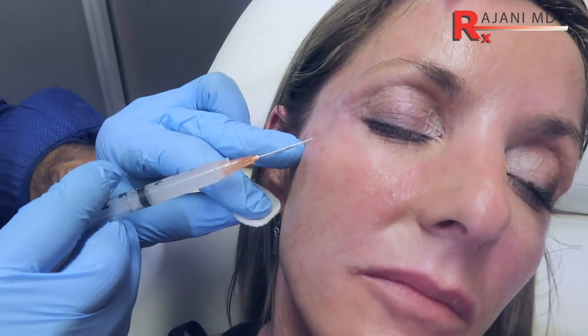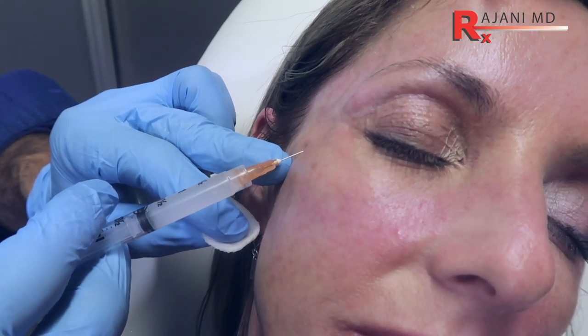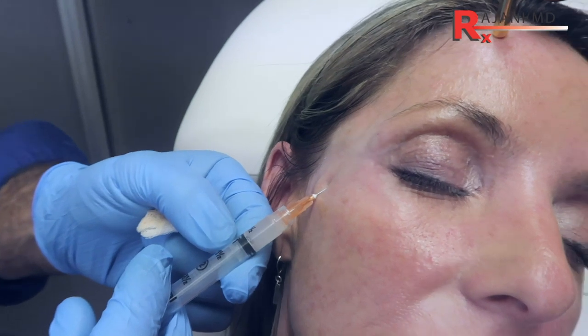The temple — we're using Sculptra as a water-based filler. When you pull back on Sculptra if you're in a vessel, you'll see it. Here's the zygomatic bone; this is the hollow we want to fill. A little poke, come in here, and the periosteal plane is where I'm going to be. You just barely touch the periosteum and pull back. If there's blood, it's a fluid — a little pull back is all you need. We're going to use a total of two mls in volume, stepping up the periosteal plane just a little bit. You can also massage it all the way up — it's avascular.